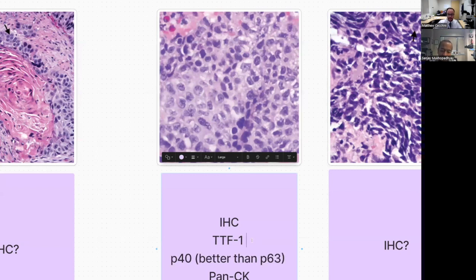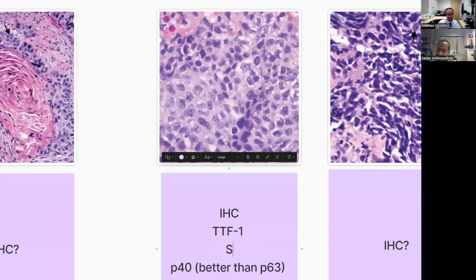Agree. And then maybe we chat a little bit about clones of TTF1 in this case as well. Yeah, great topic. And about which one and why they're different and what we should think of there. So the main clones really, I think, are SPT24 and 8G7G3/1.